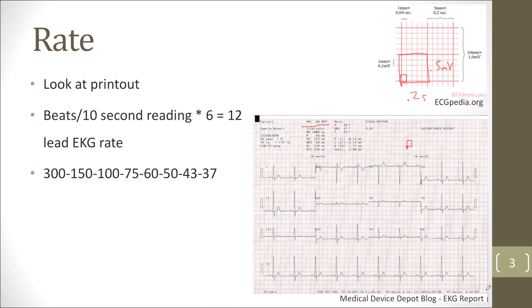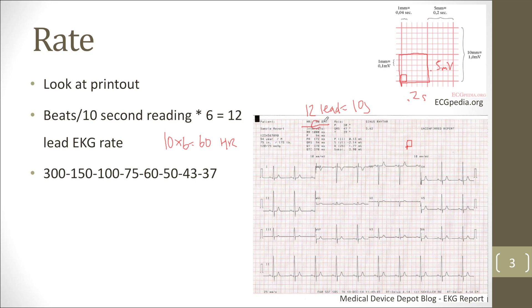In each of these EKG strips — this is a 12-lead EKG — it's going to be 10 seconds. That means there's going to be 50 big boxes, because 50 times 0.2 is 10 seconds. The easiest way to calculate the rate is to figure out how many beats there are in the 10-second reading, then multiply by 6 because 10 times 6 is 60 seconds. So if you have 10 beats within the 10-second reading, that's 10 times 6 equals a heart rate of 60. And we'll see here that the heart rate is in fact 60.